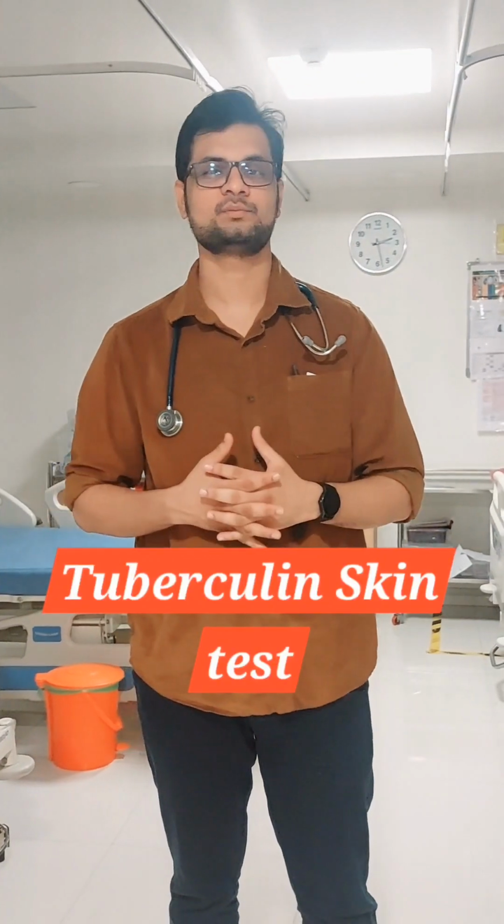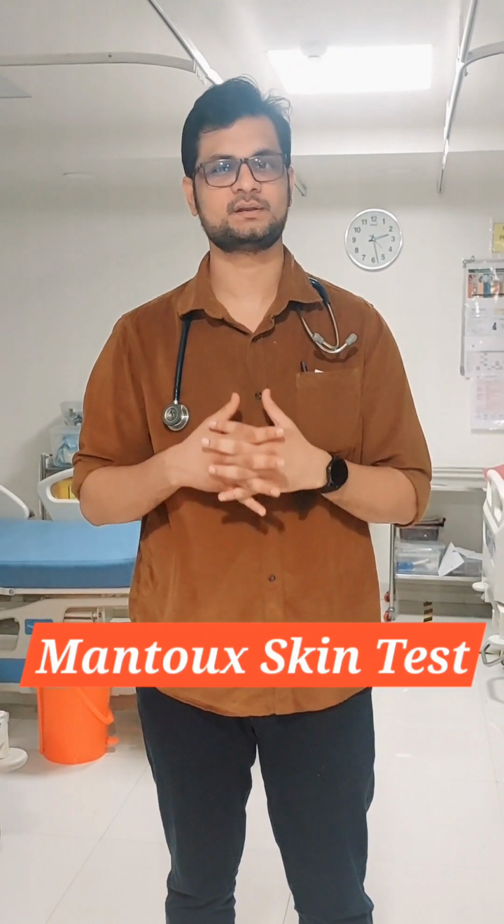So hello friends, in this video, let us see about the tuberculin skin test, also known as the Mantoux test. So let us see how this test is performed and how the result is interpreted.